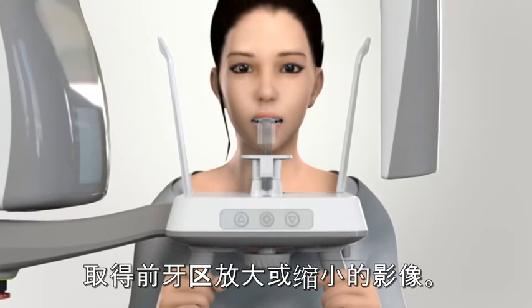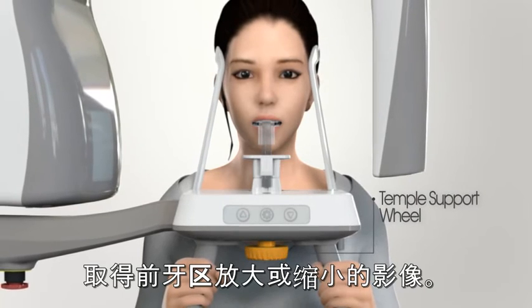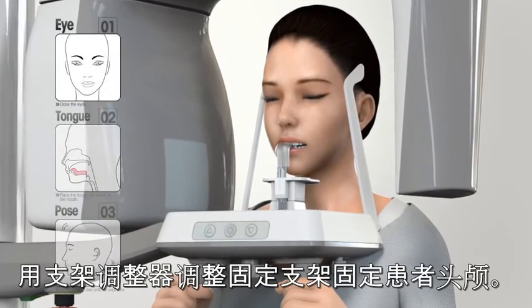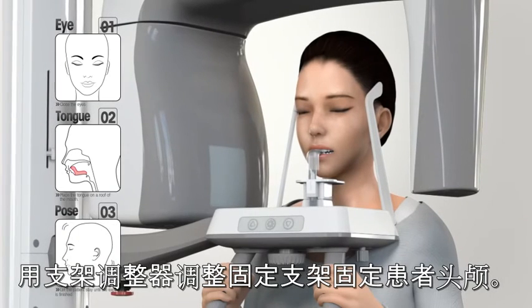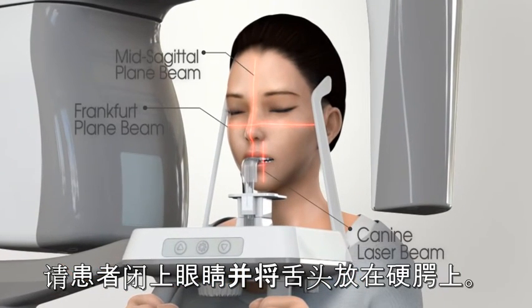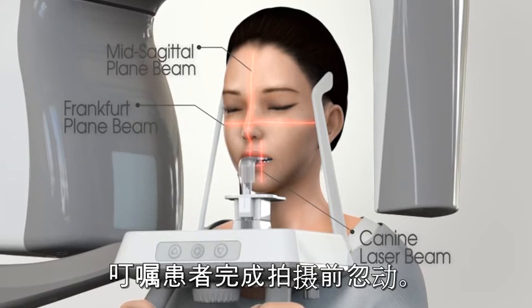When everything is ready, rotate the temple support wheel to tighten the temple support to stabilize the patient. During image capturing, ask the patient to close the eyes and place the tongue on the hard palate. Also, instruct the patient not to move until the image capturing is completed. The operator should confirm 3 beams are placed appropriately before capturing the image.